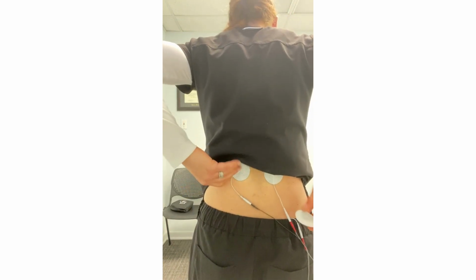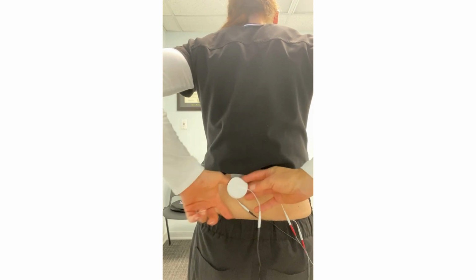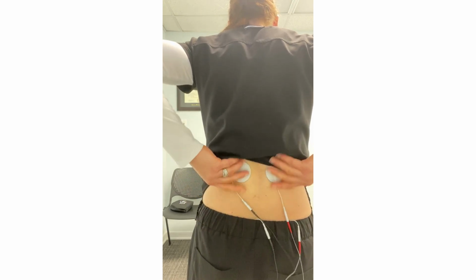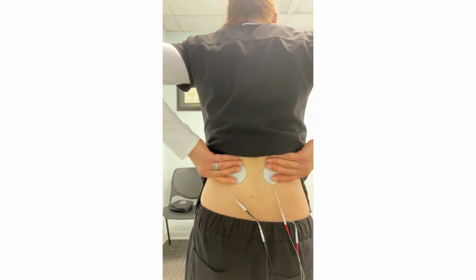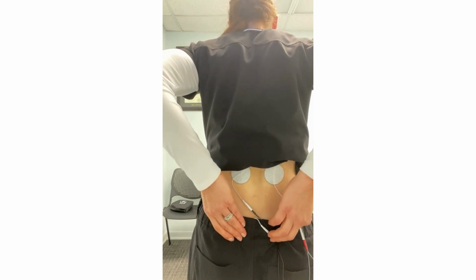And then the same thing here in the effort to be discreet. I'm going to go just below my pant line here and place that and make sure it's a good connection. So again, level pads, spine in the middle, and then the other pads are right here.